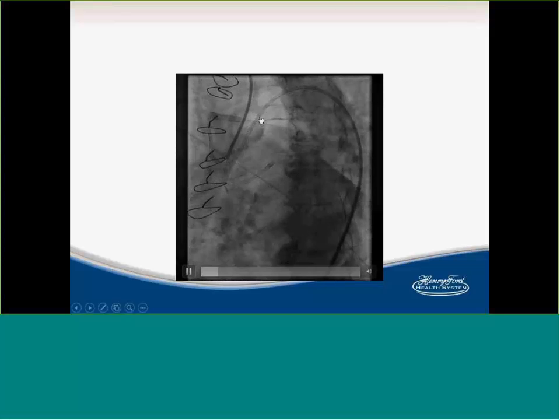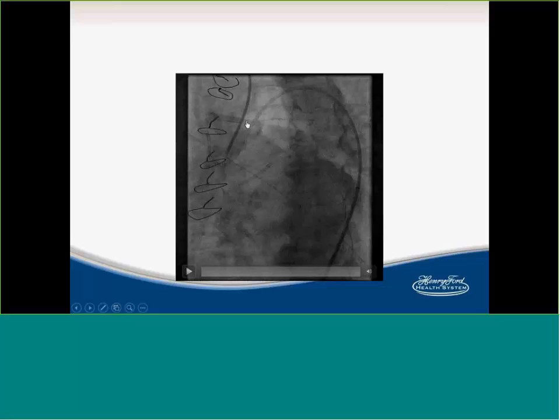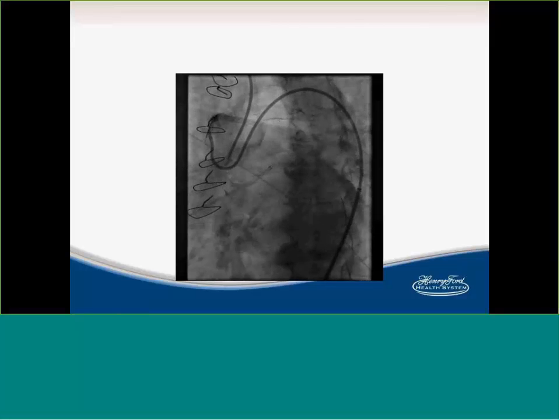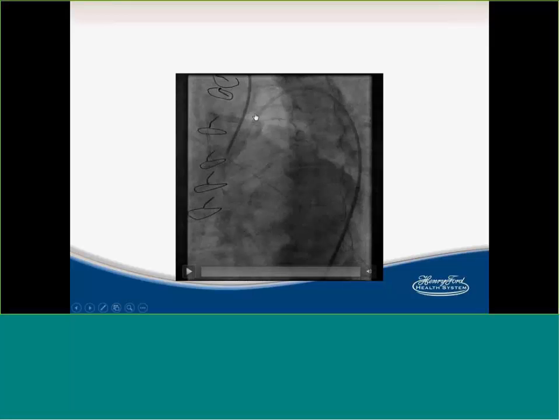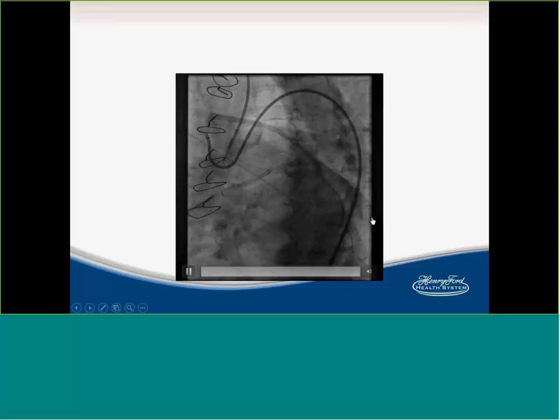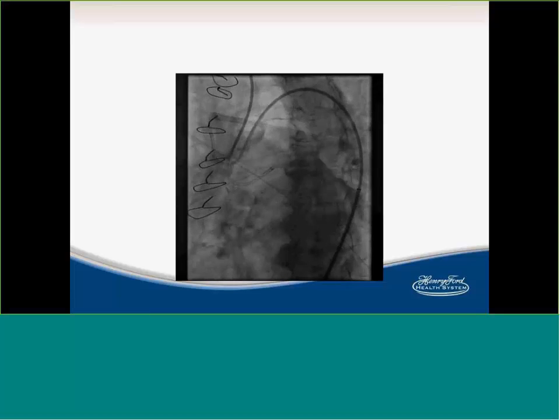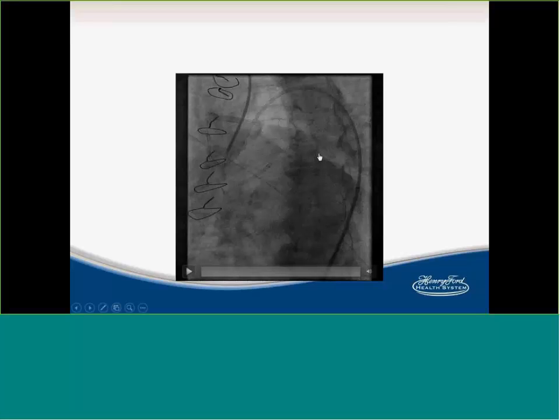And I'm not sure if you can see it correctly, but if you look here, he had a bare metal stent here, and he had a drug-eluting stent here, and at the junction, there is actually stent fracture. And I actually had to look, and in hindsight, I found that. But then, and this is open for debate, what to do with a graft that tried to kill the patient 3 times. Even if it looks open, there is a good flow in it, and we're trying to determine the answer to that question. But I decided in this patient, I'm going to open the native circulation, and I'm going to basically see what the graft's going to look like after I open the native circulation.